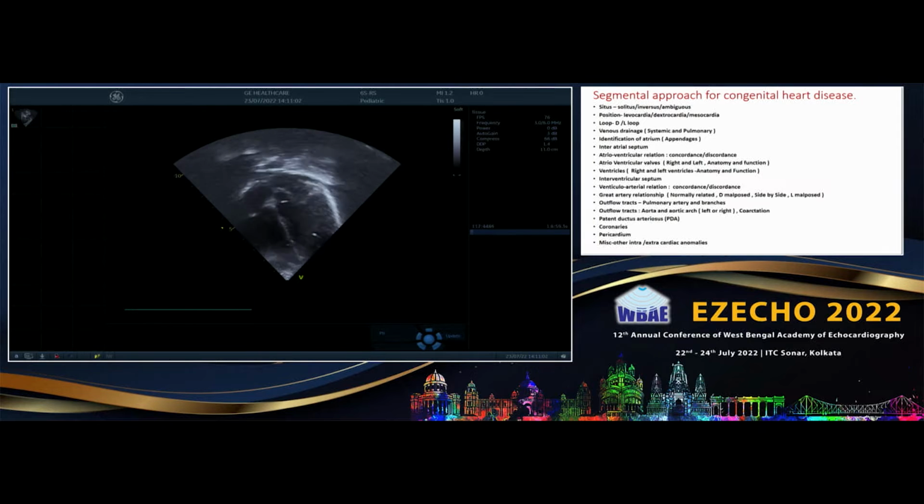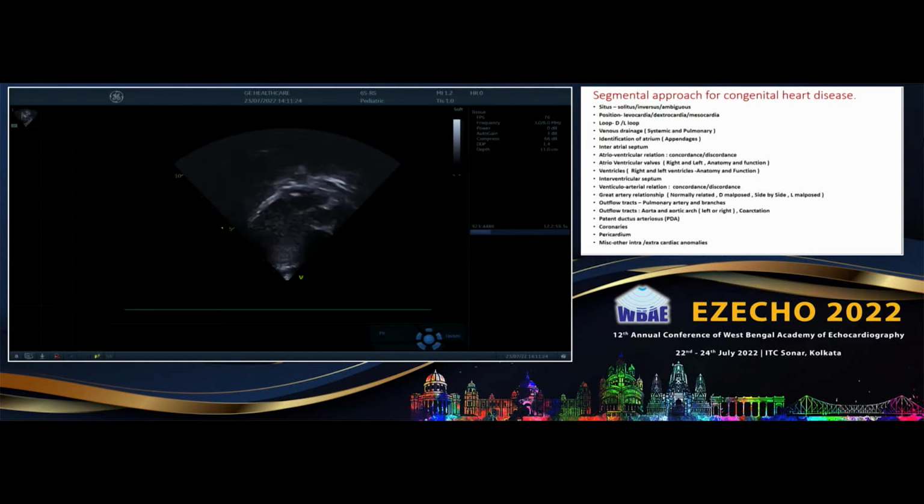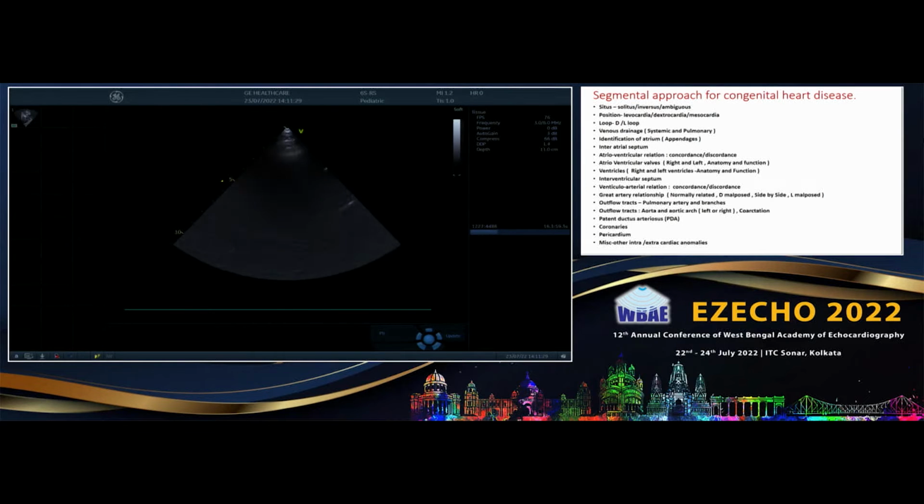the ventricle going more anteriorly, because the anterior and posterior need to be felt, cannot be seen. The operator is moving the probe, sweeping, so he knows this is anterior and this is posterior. That's why echocardiogram in structural heart or anything is more operator dependent, and we know what we are seeing. So then, I think we are just showing the structures. The functionality assessment we are just not focusing on as of now.